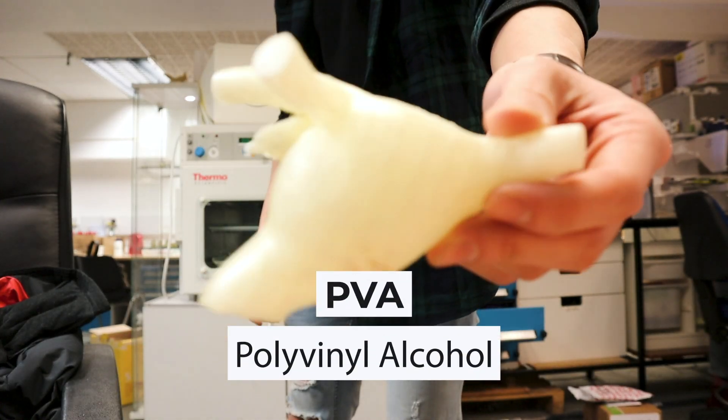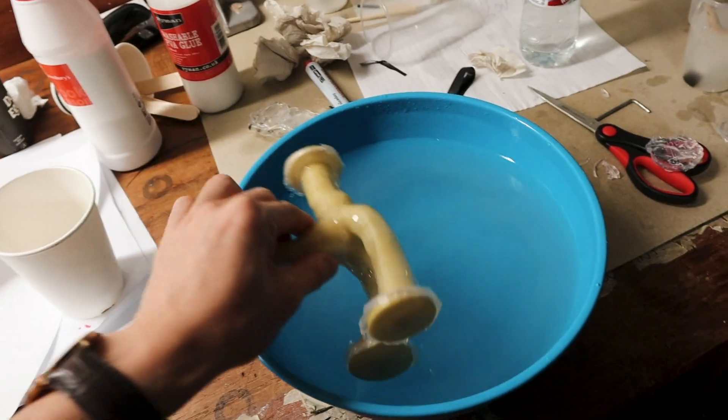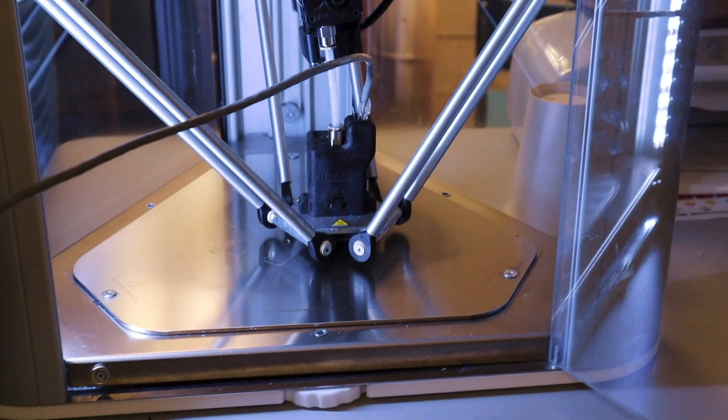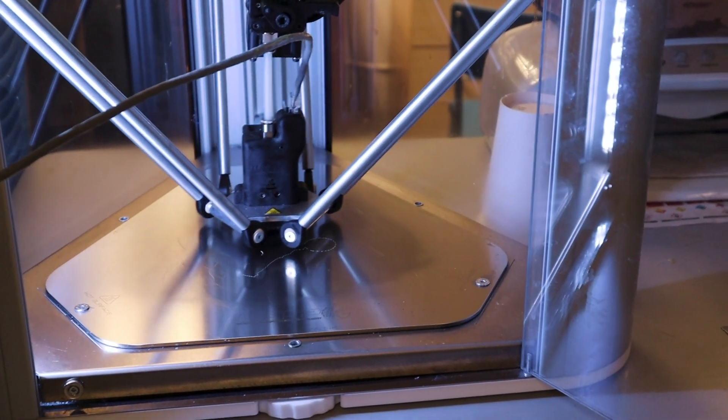We decided to print the TCPC using a water-soluble polymer called PVA — polyvinyl alcohol — which dissolves when placed in water. The printer we were using was quite fiddly and broke down a few times, so we had to repeat the process again and again. The actual printing time was quite long and the machine had to run overnight, because a 3D printer prints all the support structures for the product before printing the final product itself.